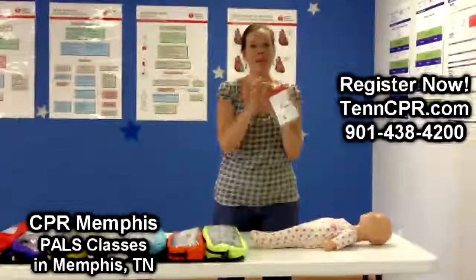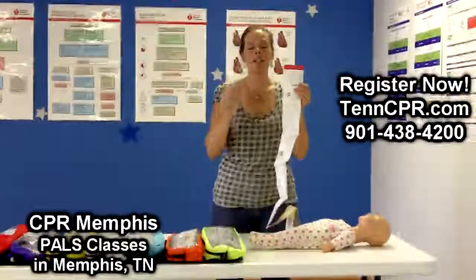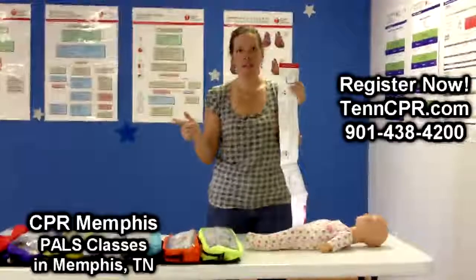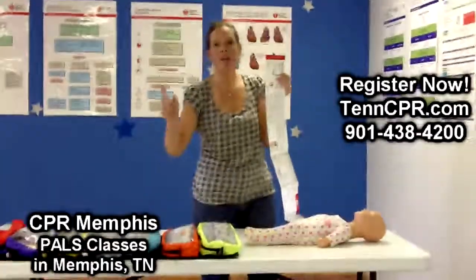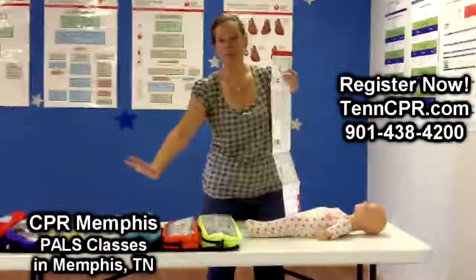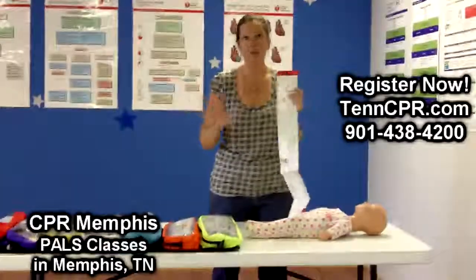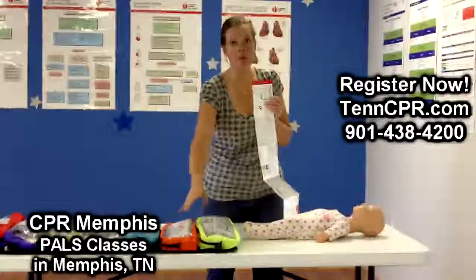We have this wonderful Braslow Tape that folds out so we can assess the child immediately, whether it's their weight or their length. We have quick access to not only the IV catheters, but suction, ET tube sizes, and airway adjuncts — everything is included in these kits. So you don't have to fumble around your doctor's office, crash cart, or the ER — it's readily available for you.